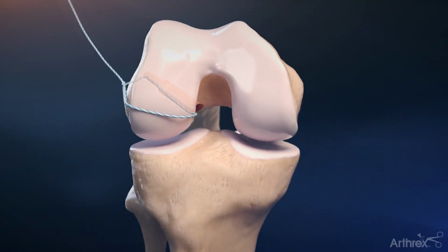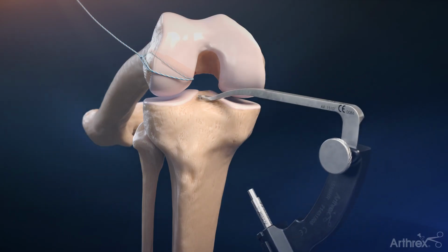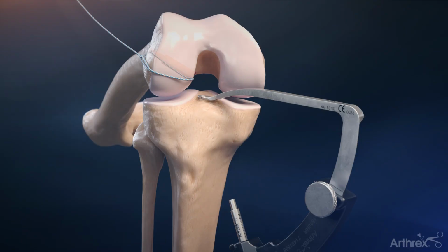Place the ACL tibial guide over the ACL tibial footprint arthroscopically. Adjust the angle of the guide to the desired tunnel position and tunnel trajectory, and then lock into place. Push the ratcheting drill sleeve down to bone. Advance the FlipCutter III drill through the ACL tibial footprint.